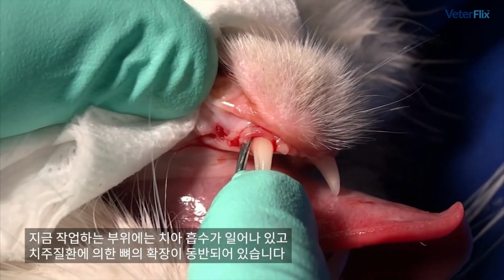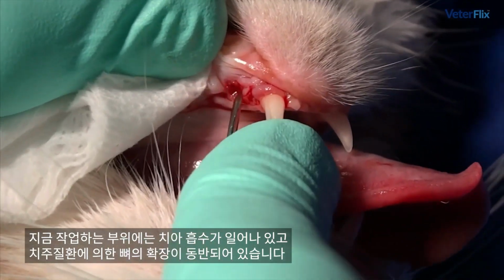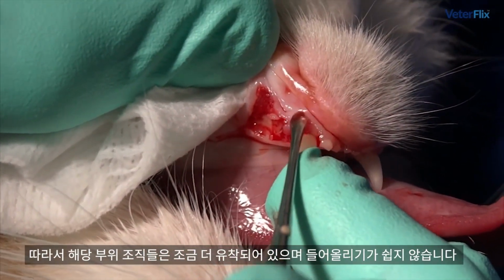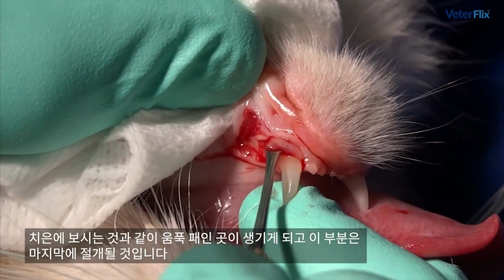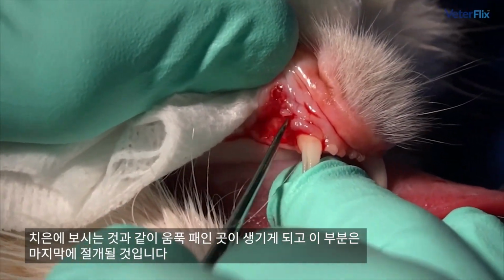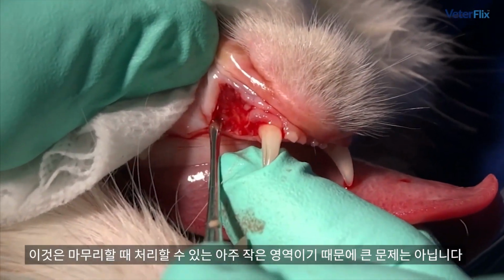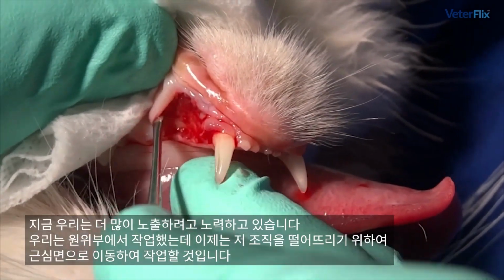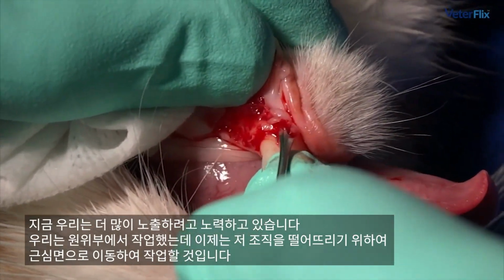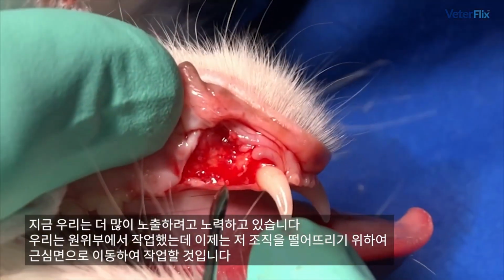Right here where we're working, because of the resorption, there's a little bit of bone expansion there from periodontal disease as well. So the tissue is a little more adherent to that area, and it's a little more difficult to elevate. There's going to be a little bit of a ding in that gingiva, as you can see there, because of that, and that will be excised at the end of the procedure. That's not a big problem because it's a very small area. We can take care of that at the end when we're through. Right now we're working to get more exposure. We're working distal, and now we're working toward the mesial part of the attachment, trying to release that tissue.